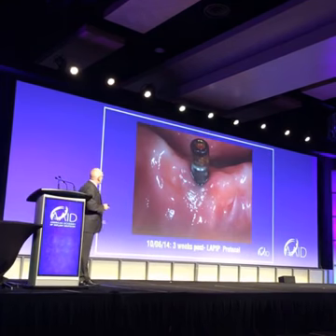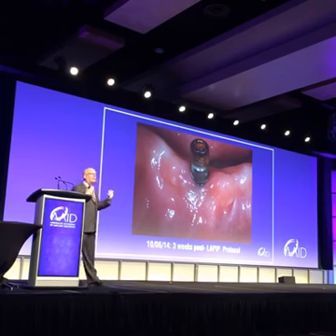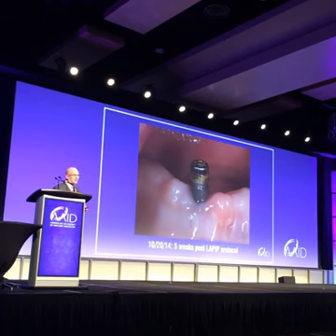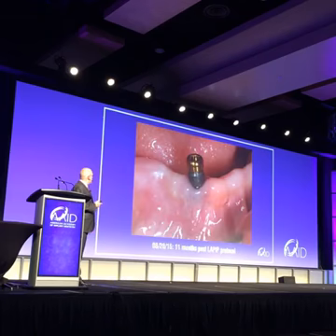Three weeks later, she still hasn't figured out she has to brush, but look, we got natural resolution of the inflammation. I didn't cut away anything, that's just the body resolving the inflammation. Now she's starting to brush. Here's 5 weeks post the LAPIP protocol. That looks pretty healthy. That looks nice. 3 months, looking good. 11 months, looking good. She finally got some religion.